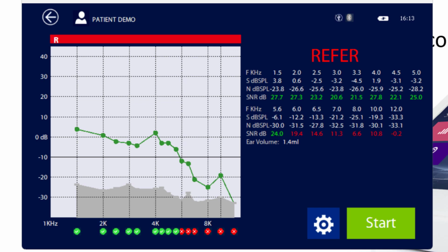I did not demonstrate another thing, which is super interesting, but it's very difficult to demonstrate by myself. Our measurement became a lot better at handling noise. So during the measurement, it's giving a lower weight to the measurements that are noisy and giving a higher weight in the average to the measurements that are more quiet.